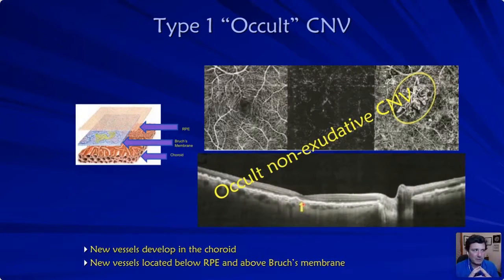I'm finding these all the time, which is really, really cool. And I've been working with my retinologist that comes into town from Pittsburgh, they come up to Altoona. My first 3 of these that I sent over, they were like, Greg, we understand that there's a 15.2 times risk of turning into exudative, but we really don't know what to do with these. You know, your technology has outpaced where the studies are. So we watched them closely, and all 3 in the first 3 to 4 months bled and vision dropped, right?